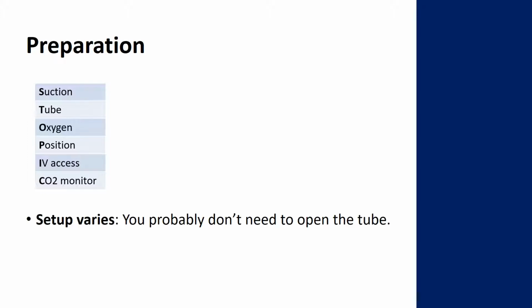I think setup does vary a little bit between sedations and intubation, and certainly between staff members as well. But as an example, if I was tubing somebody, I would get an endotracheal tube, properly size it, put a stylet in it, and test the cuff. But if I was just sedating somebody, I probably wouldn't do anything except know that I've got the tube and that I've got the right size of the tube. So you don't have to do everything that you would do, but you've got to get at least the equipment and at least know that it's all there.